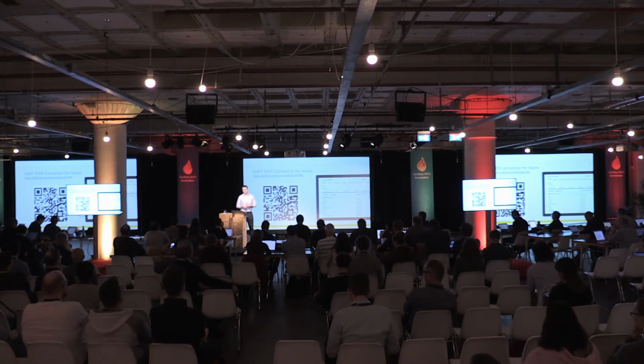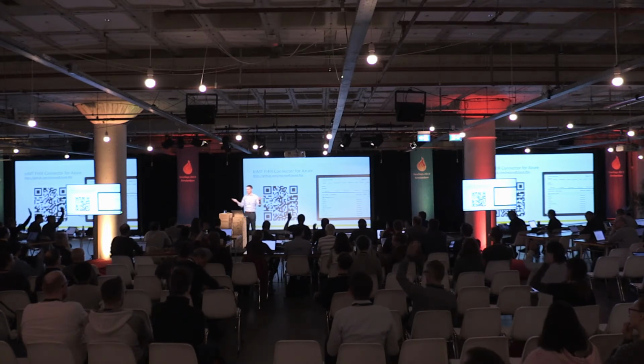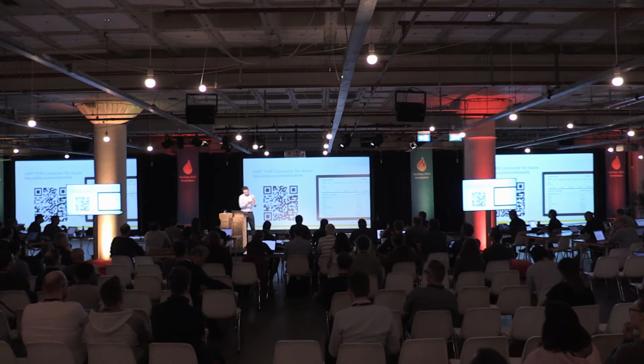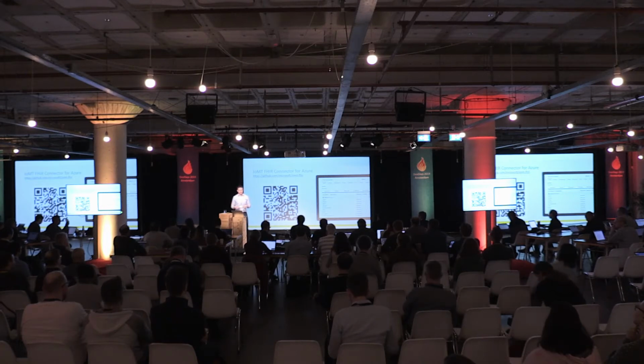But first, I'd like to get an assessment of the room. So who here has a wearable or some kind of device that they wear day to day? I myself have my Fitbit currently, and I'm also wearing another device here on my arm. This particular device samples at very high frequency. Right now it's set to sample every second. And it captures various biometric data points. For purposes of this demo, it's capturing my heart rate. And right now it's sending it up through the connector into a FHIR server.